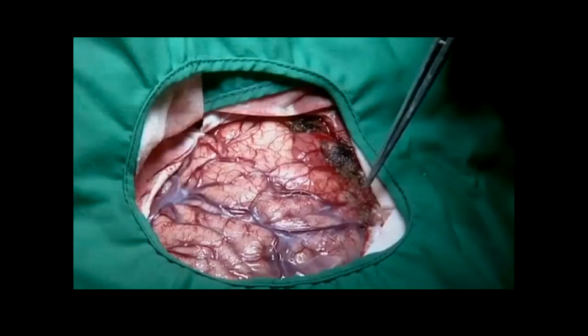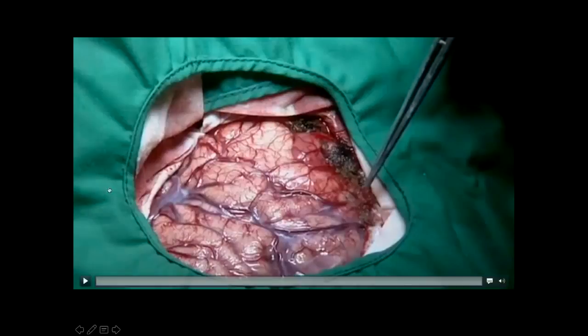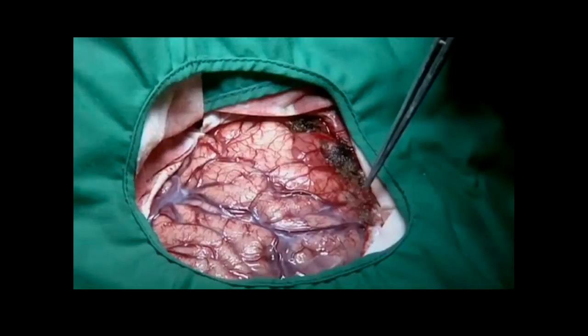And here's why we're doing it. I'm going to just show you a 30-second clip. This is a brave young woman who basically had a brain tumor. And we want to take out the brain tumor, but avoid language. And the only way to do that is to first put her under, open up a craniotomy, wake her up, and do language tasks as we try to knock out different brain areas with an electrical pulse, okay? This is reality, okay? I know it sounds a little strange, but this is what we do.